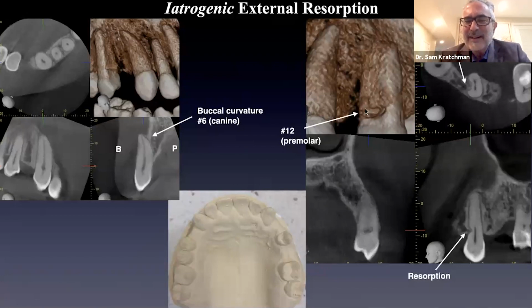And this here was damage of this tooth. You can see here, the reason why I show this is that it's so chronic that the resorption was from him digging a knife into and scraping the PDL. And then he must have gone away from that spot. And with time, what happens is ankylosis. And ankylosis means it's replaced by bone.